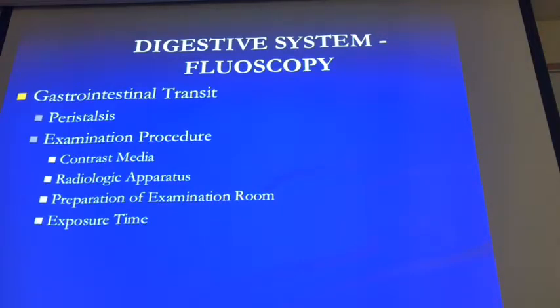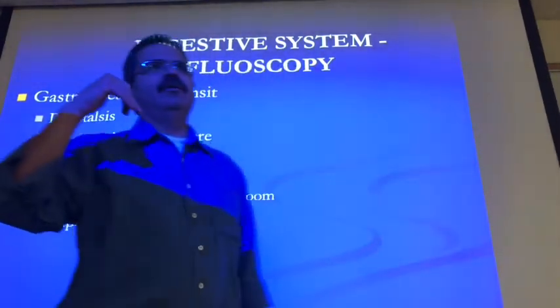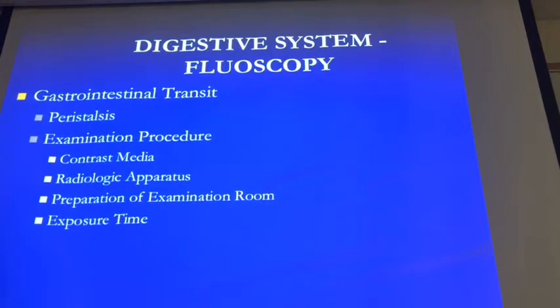Because there's a lot of scattering radiation. Anytime you're dealing with fluoroscopy, you have to be aware of the exposure time. With the systems that we have now in place, hardly ever do you have control of the technical factors. It's pretty much done by the equipment, and so all you can do is minimize the exposure time. Now, do we have full control of it? No, it's the radiologist, but you have to be aware of it. And sometimes you need to remind them.